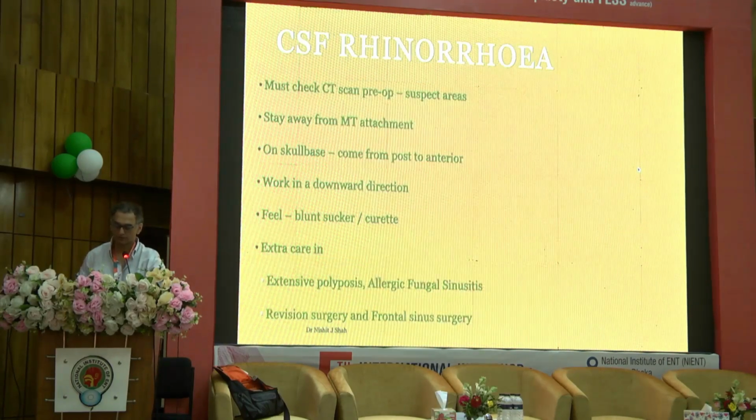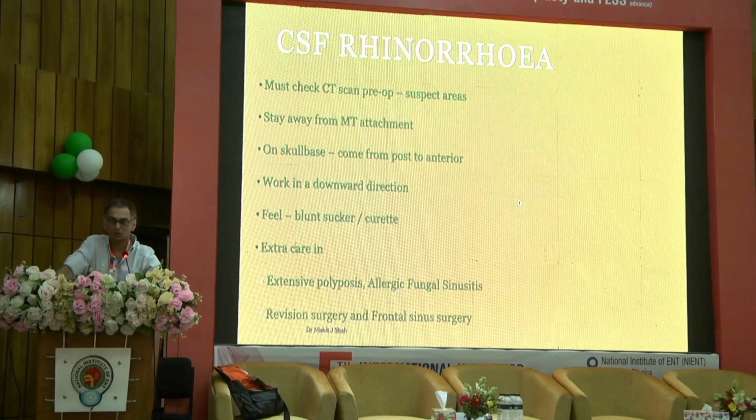So we come to our last major complication, which is CSF rhinorrhea. Again, importance, check the scan. It's not necessary for your cribriform plates to be bilaterally symmetrical. One can be type 3, one can be type 1. So look at each area separately, stay away from the middle turbinate attachment. Commonest site of injury is the lateral lamella of the middle turbinate. On the skull base, best to come from posterior to anterior, because the posterior ethmoid skull base is very easy to define. Anterior ethmoid, many more cells, more difficult to define. So work in a downward direction if you're going from anterior, upward direction if you're coming from posterior.